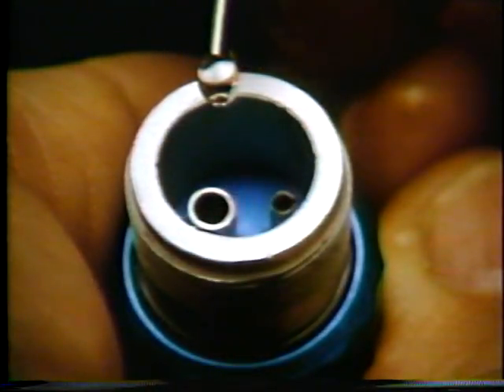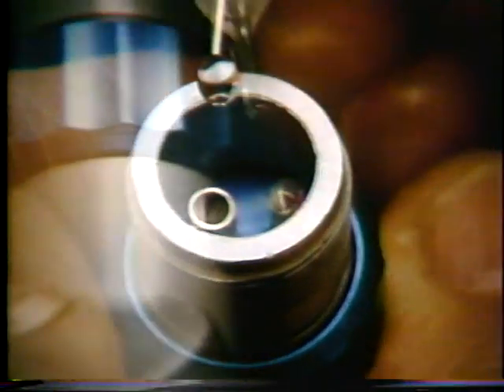On the back end of the motor, put 3 drops of True Torque into the largest tube. This tube is the air line which runs the turbine motor. Hold the motor upright for a few seconds to let the oil run down into the turbine.